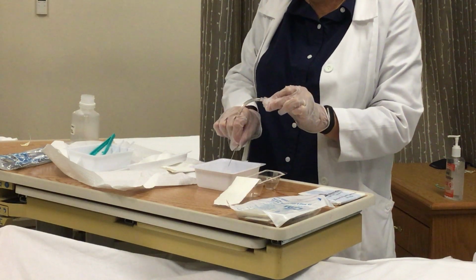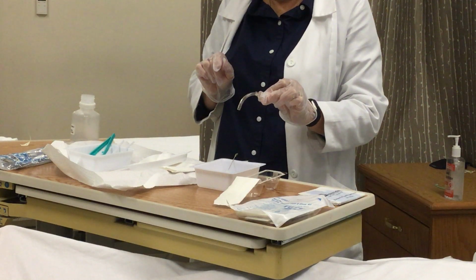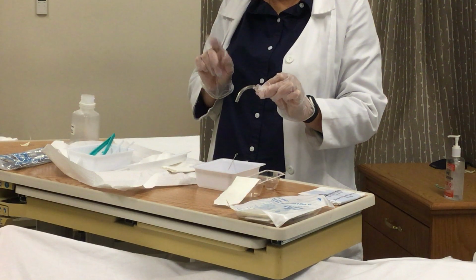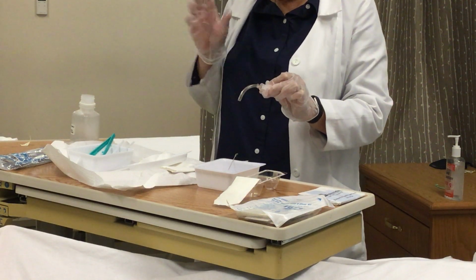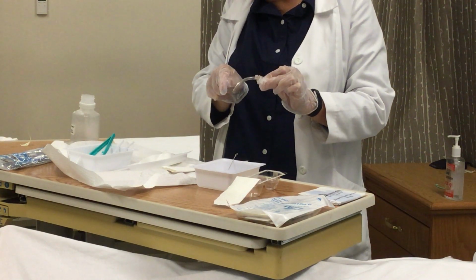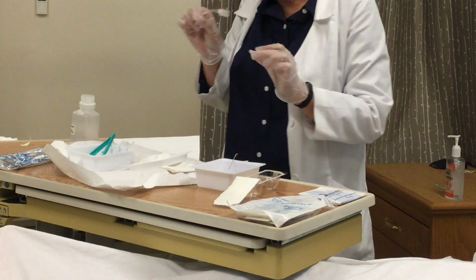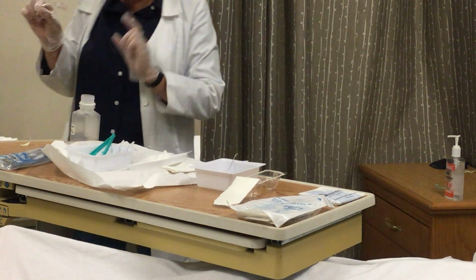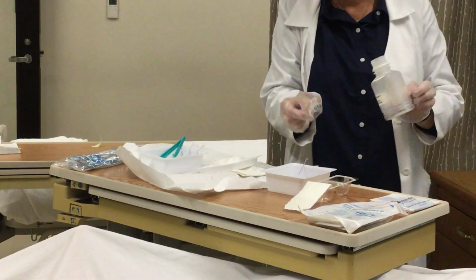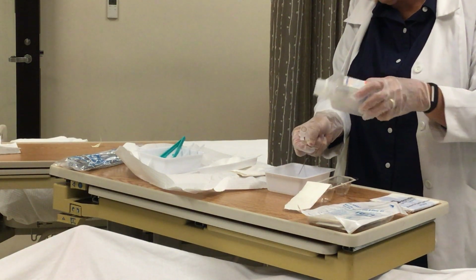I've completed the cleaning of the inner cannula. Hold the inner cannula over the basin and rinse it with normal saline, using non-dominant hand to pour the normal saline. So we're going to switch things up just momentarily. Since this is my sterile hand, and this part that goes into the patient's tracheostomy tube is considered sterile, I'm going to grab there. With my non-sterile hand, since the bottle is not considered sterile, I'm going to pick it up. I'm going to pour the solution over that inner cannula to rinse it off.